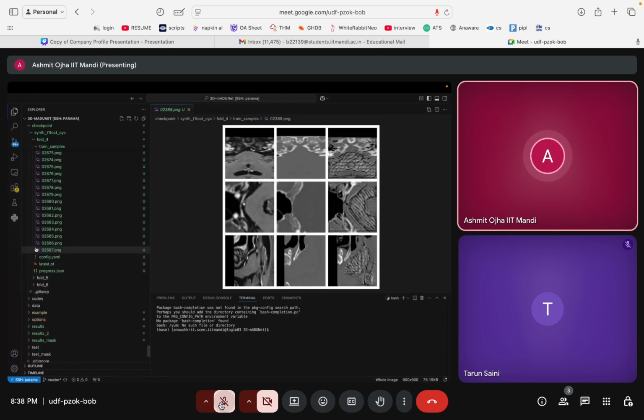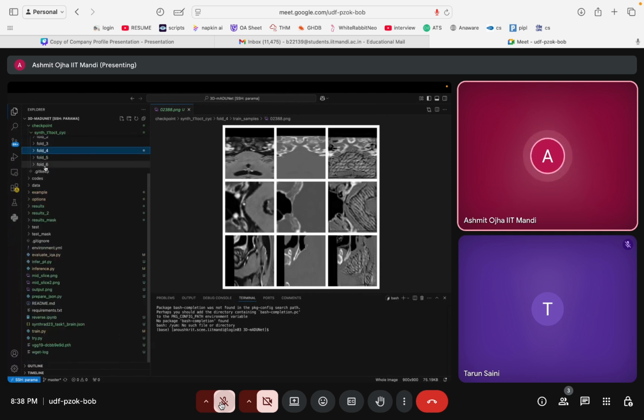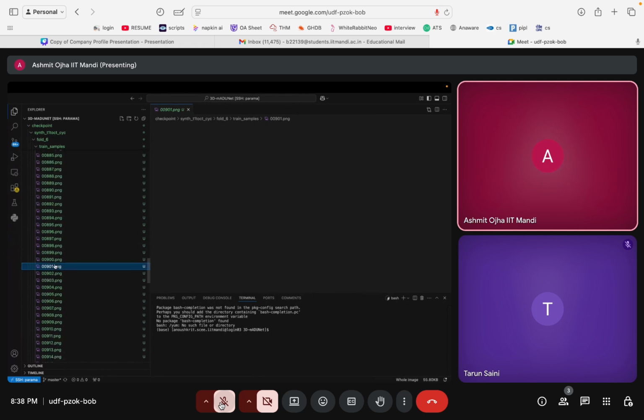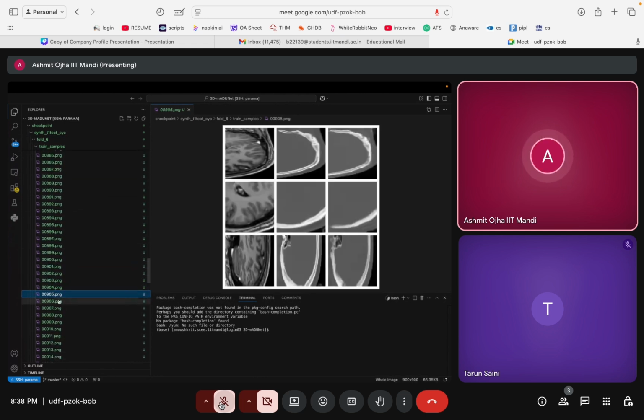Finally, when we extended it using StegoGAN training, we were able to solve this artifact problem, and even by the end of our training, these artifacts did not come up, and the results were very nice.